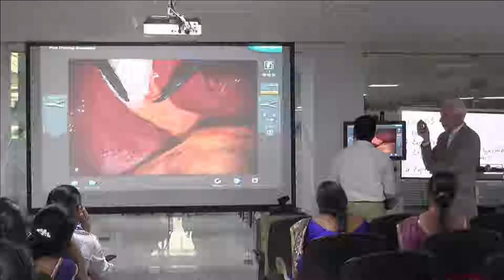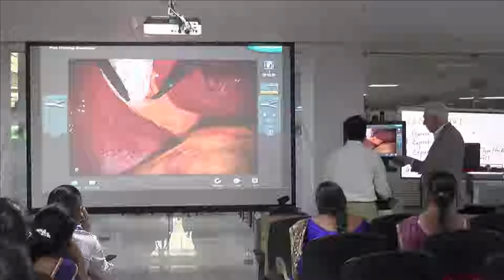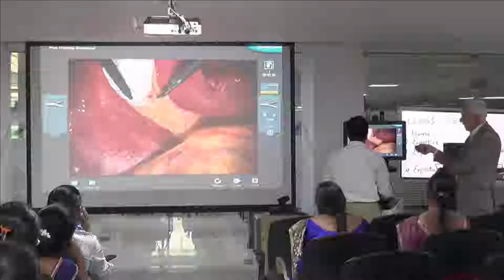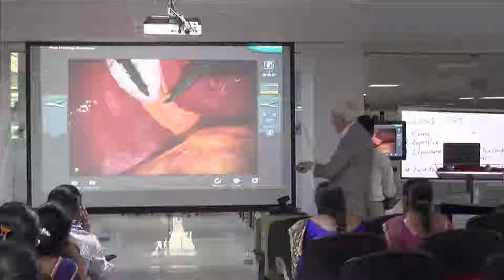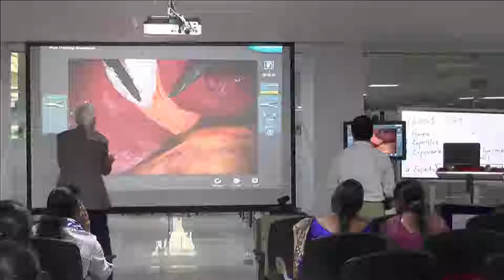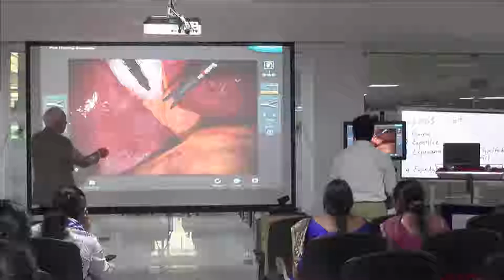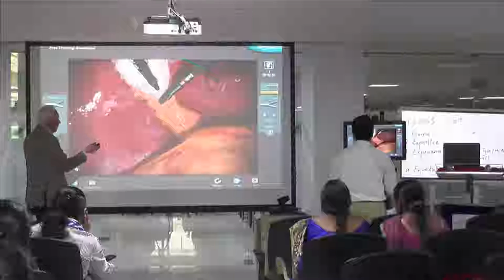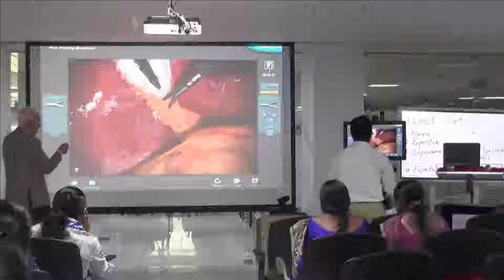In real life, in a patient, the peritoneal envelope is pretty short in this aspect. So to develop the pedicle of a gallbladder, you need to take down this part of peritoneal envelope and release this tissue so that the cystic duct and the artery get very mobile, and then you get a much better exposure of a triangle of Callot.